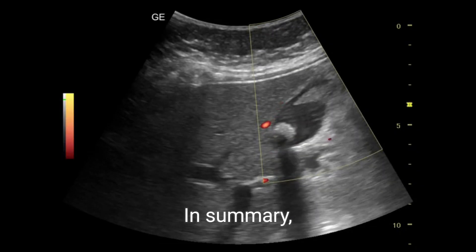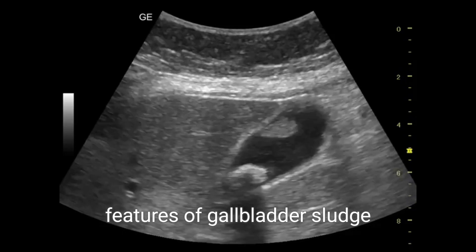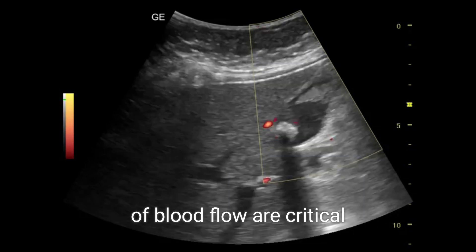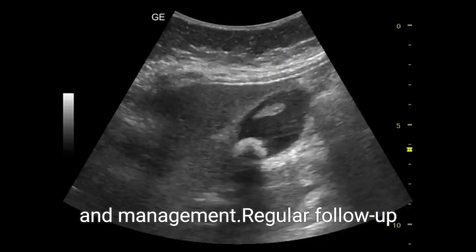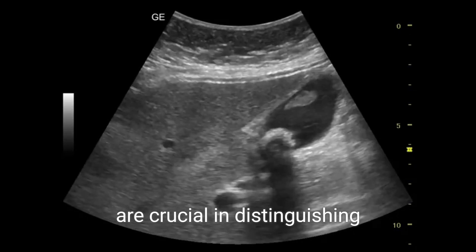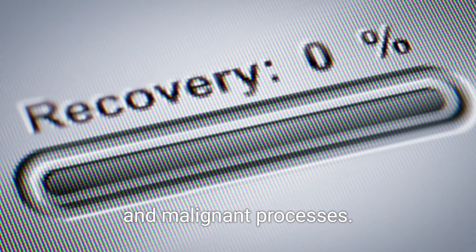In summary, recognizing the distinct ultrasound features of gallbladder sludge and using color Doppler imaging to confirm the absence of blood flow are critical for accurate diagnosis and management. Regular follow-up and thorough clinical assessment are crucial in distinguishing between benign and malignant processes.